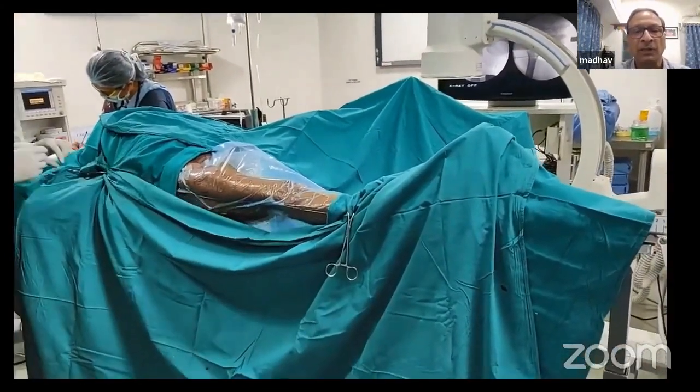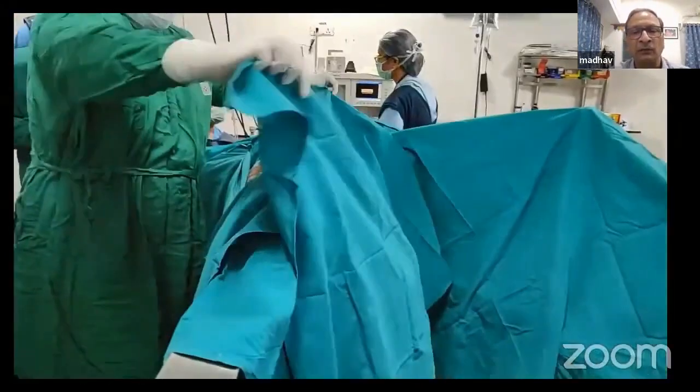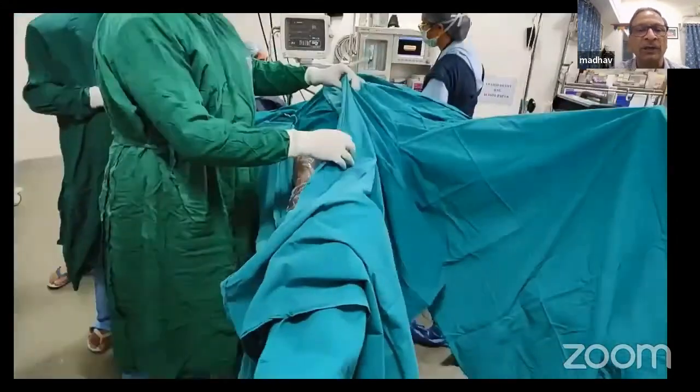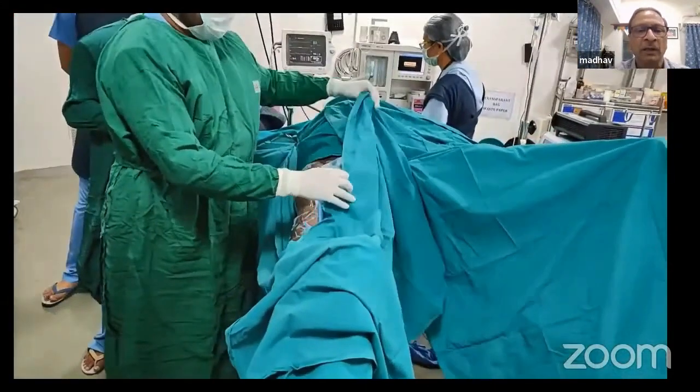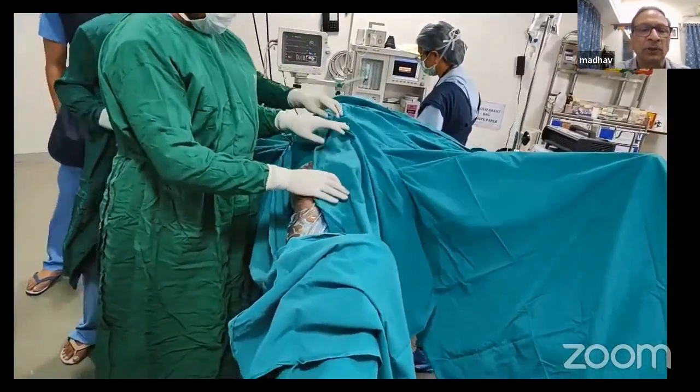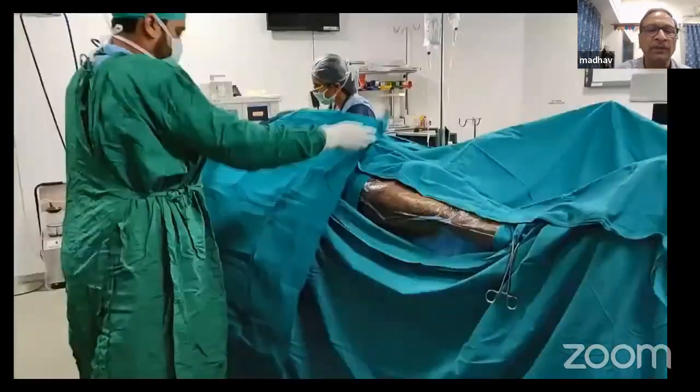On the lateral side of the limb to be operated, you put a big sheet.